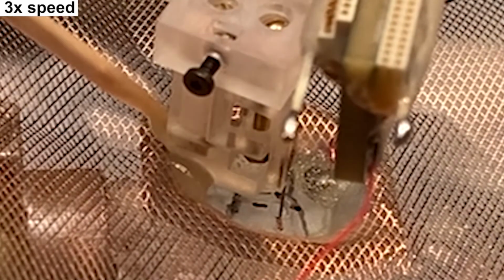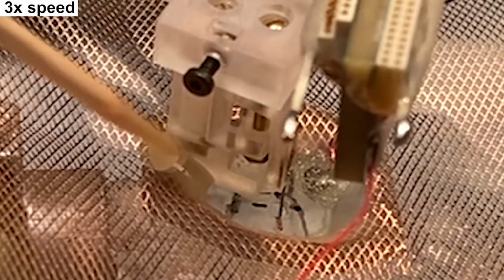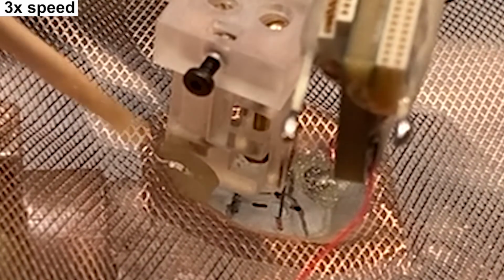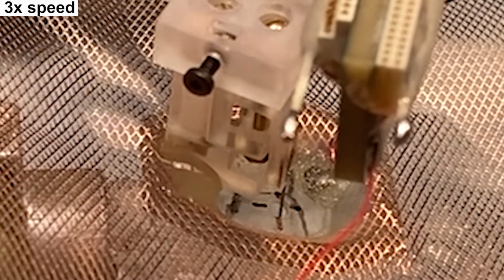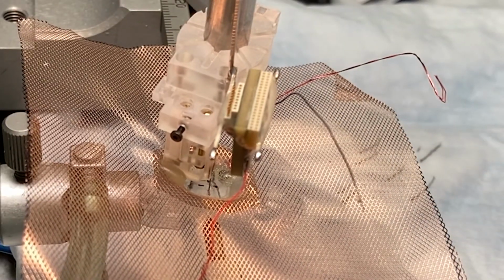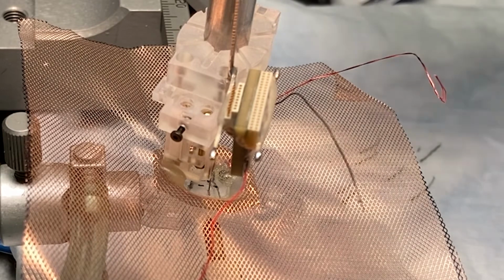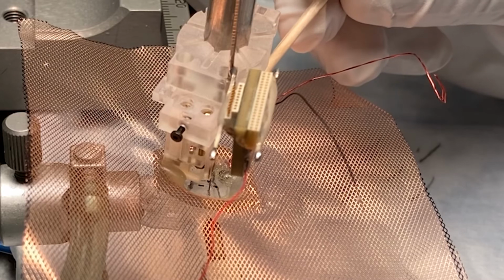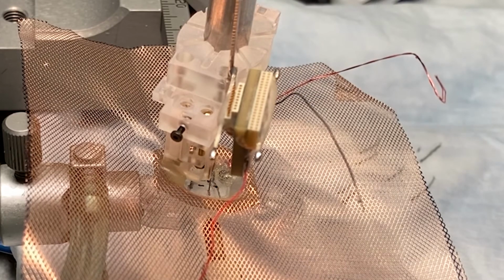And here, again, you need to use relatively liquid cement to let it flow between the skull and the shell component, but not too liquid, because if it's too liquid, then it can spread into your craniotomy, and you can cement your silicone probe. If it does happen, don't worry, try to remain calm, and you still have a couple of seconds to remove it from the craniotomy.